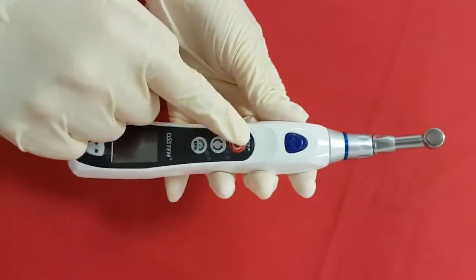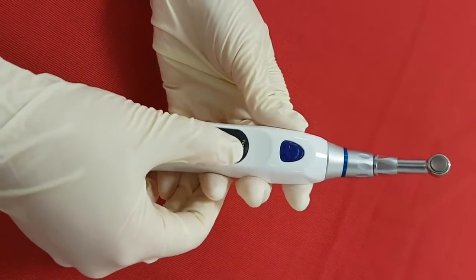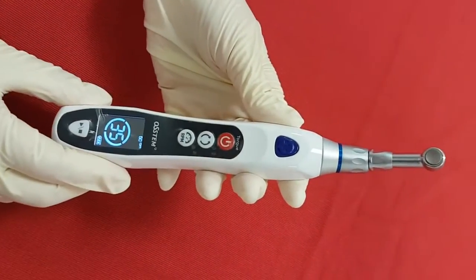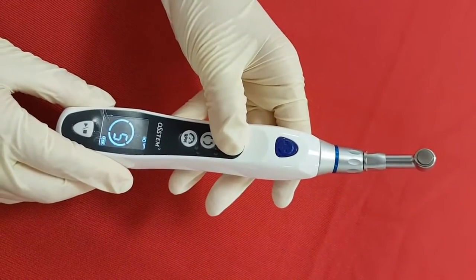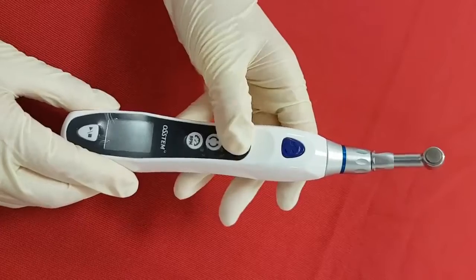Let me show you the power button in the middle of the body. When you press it for over 3 seconds, it will turn on. Vice versa, you can turn it off by pressing it again for over 3 seconds.